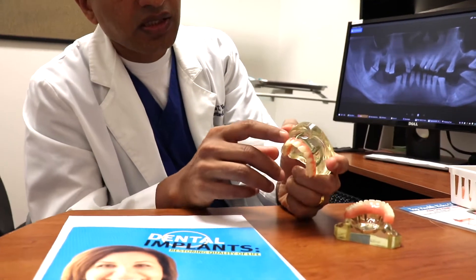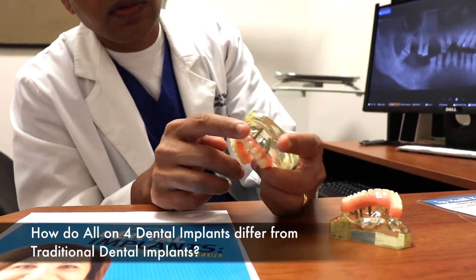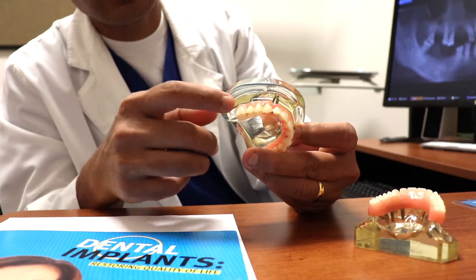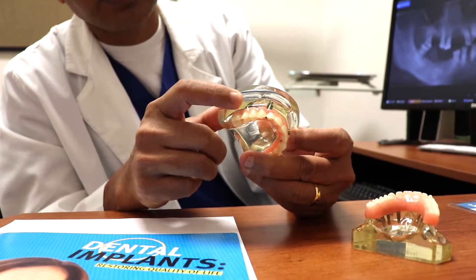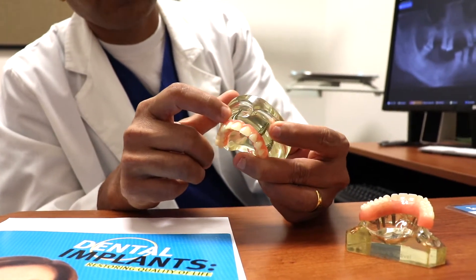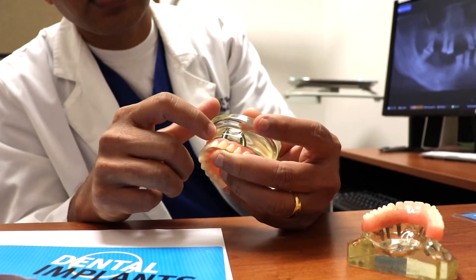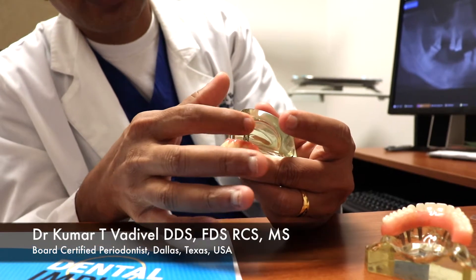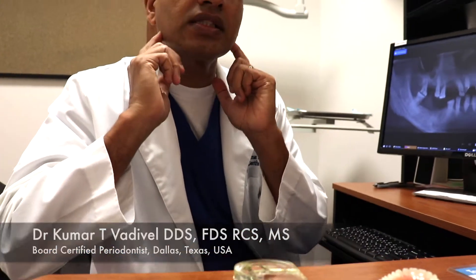All the implants are placed just in the front, and to avoid the sinus cavities, we tilt the implants in the back. The back implants are tilted and the front implants are straight, so we can avoid the sinuses in the back and avoid the nerve in the bottom in the back.